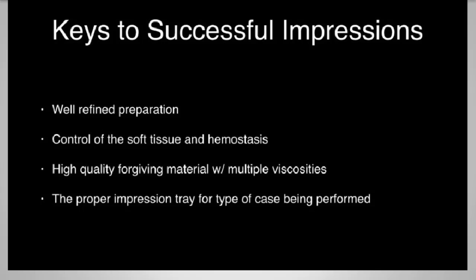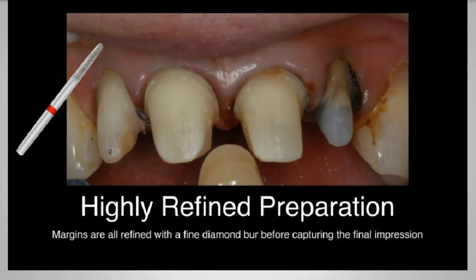We also want to utilize the right tray. A full arch impression tray is always a great thing, but the reality is a lot of triple trays are used in private practice today. So can we develop a series of best practices when looking at triple trays? We'll talk about those concepts.